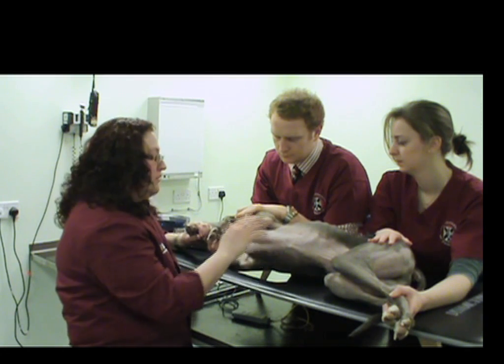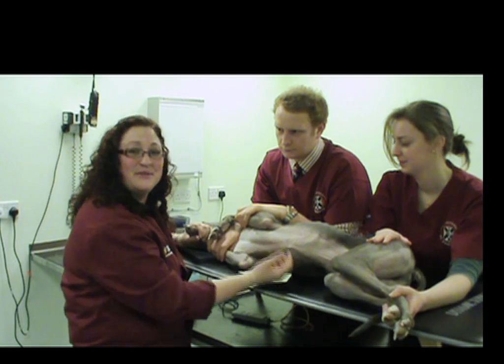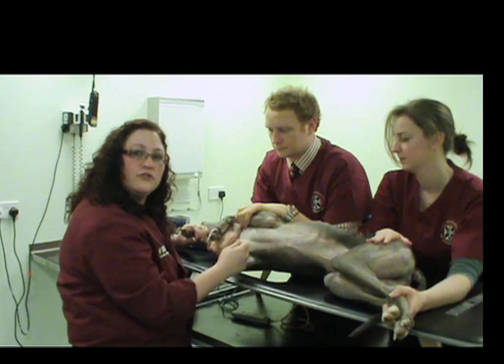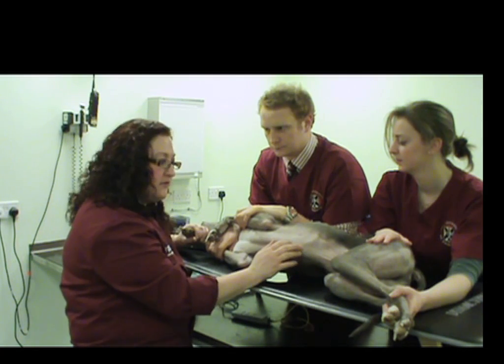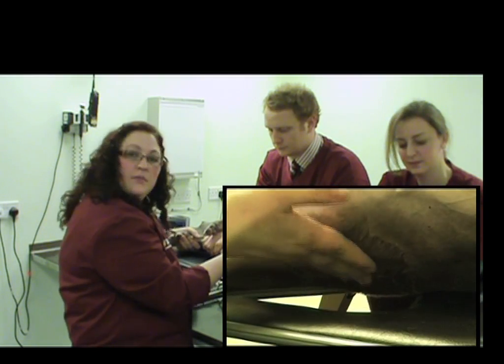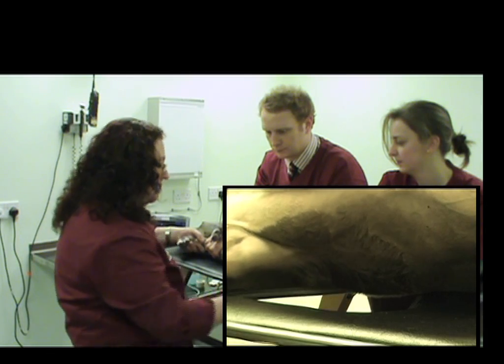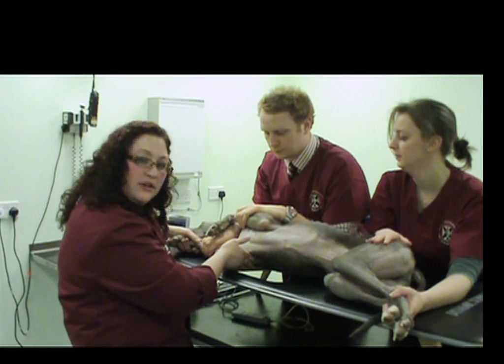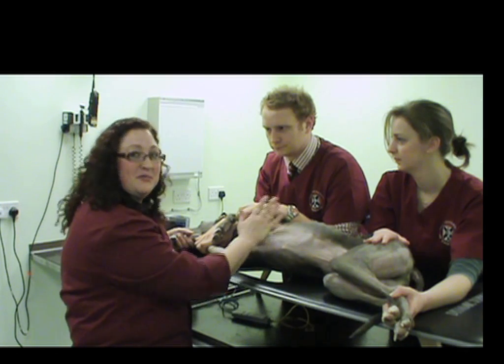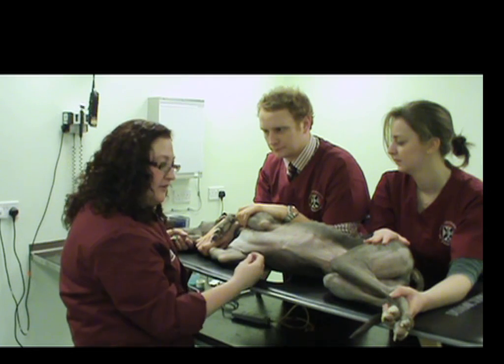Our patient is prepared, and the other important consideration is our assistants — they play one of the most major roles when performing an echo. Having the patient appropriately positioned will really help so you're not struggling to gain access to the heart. We're in right lateral recumbency with two assistants. We want the apex of the heart overlying the notch in the table so we can gain access. This includes pulling the dependent leg cranially and ensuring it stays there throughout the exam. Our patient is very relaxed, and the key is being calm, quiet, and methodical. We're ready to get started.